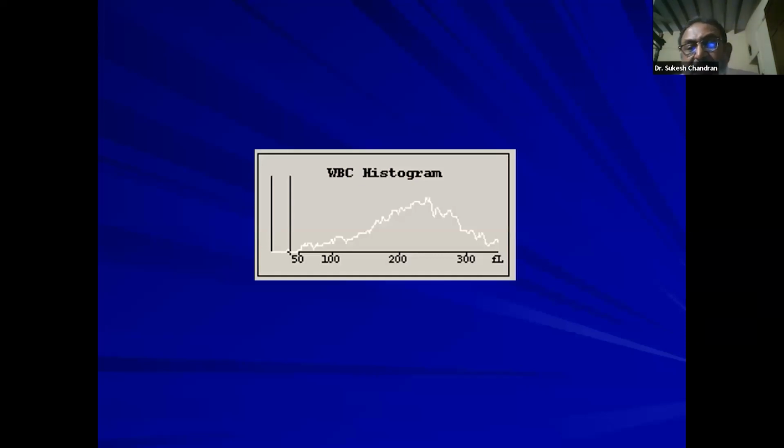Now, if you see a WBC histogram like this, you must realize that I can't see a lymphocyte, but lymphocytes are there. If the lymphocyte peak cannot be seen, that means the peak on the other side is so large, maybe the white cell count is 300,000, 3 lakhs. That's why the lymphocyte is dwarfed. Now, what is this 3 lakhs? It's predominantly neutrophils, and you can see that it is left shifted. The slant is higher to the left. So you can see that there could be metamyelocytes and myelocytes.